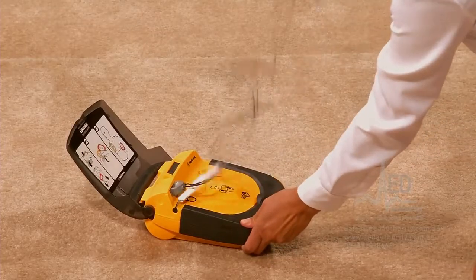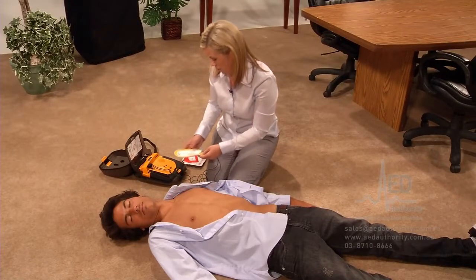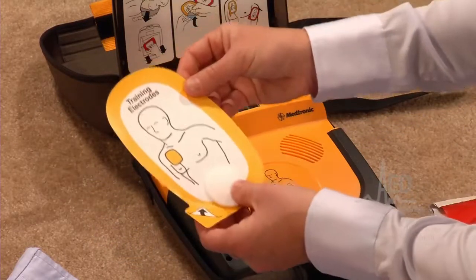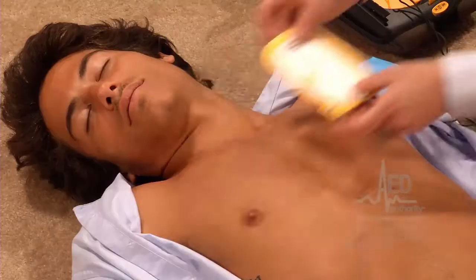Pull the red handle to open the bag. These are the electrode pads — look at the pictures on the pads. Peel one pad off the blue plastic and apply it to bare skin, exactly as shown in the picture.